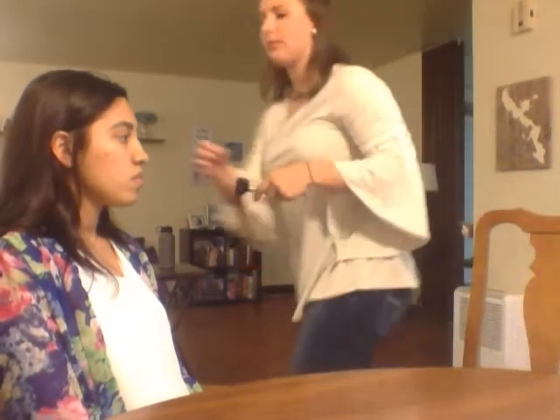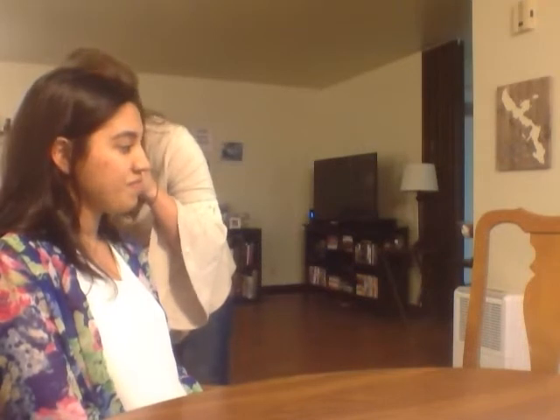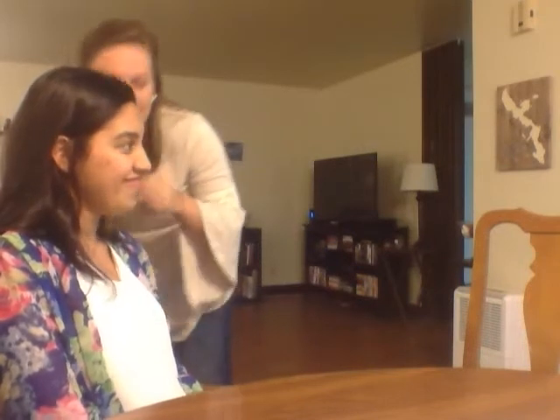So yeah. Then I will check her ears next. I will look at her external canal, make sure that there's no swelling, redness, and that both are symmetrical as well. When I look into her ear, I'm going to pull back and up, and if she was a child, I would pull back and down. So when I look, I will pull back and up and look into her ear and let her know.